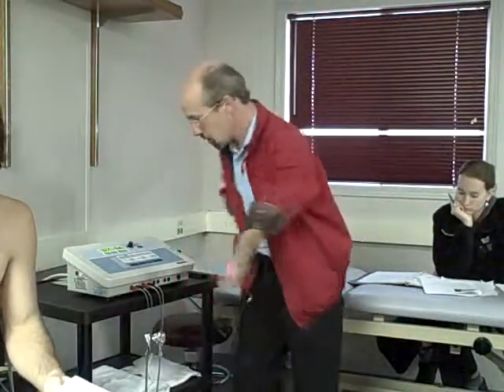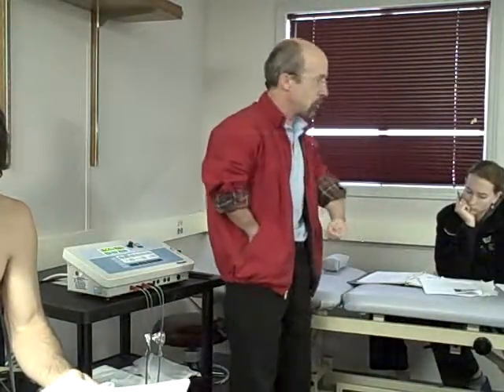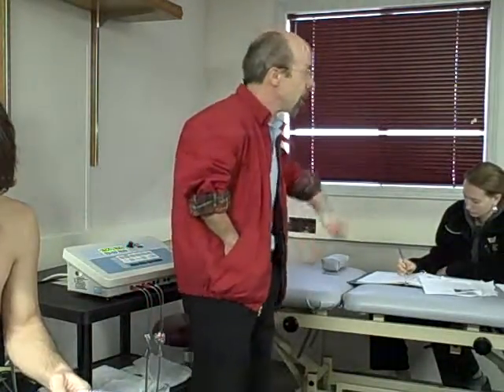So again, conceptually speaking, just to get your mind around it too. So IFC, which is the very next one here, it says pre-mod IFC. Pre-mod is a pretty common term. It means pre-modulated, and it's basically with modern microprocessing, they claim you can imitate the comfortable low-frequency therapeutic value, but just using 2 electrodes and not the quad polar field that you're setting up.